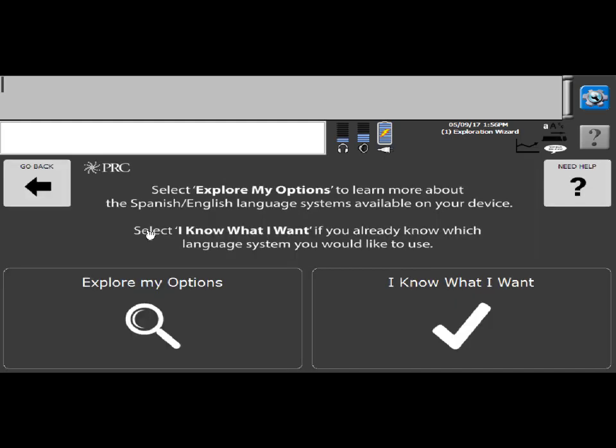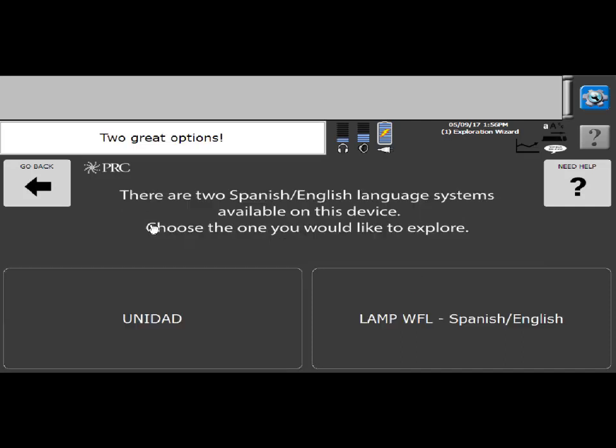And then you have two options. You can explore and see what vocabularies are available in the device, or if you already know what you want, you can load the vocabularies. So for now I'm going to select explore my options.